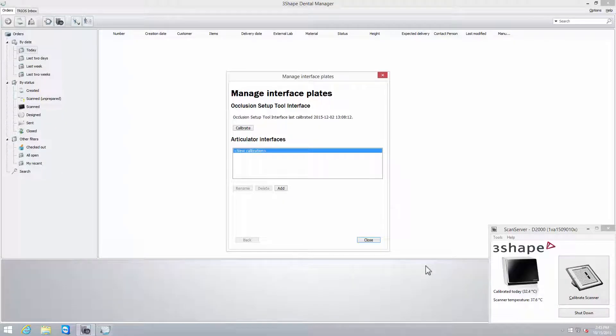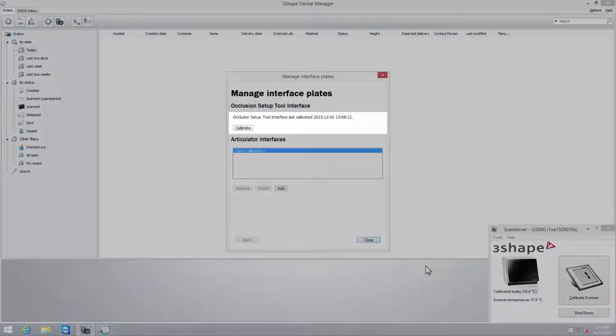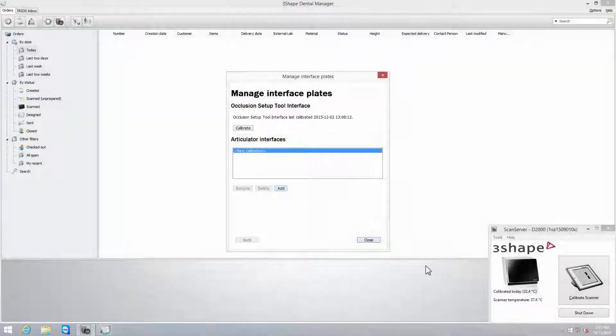In the Manage Interface Plates window, a new calibration date will be visible. Calibration must be done once, but we recommend recalibration if the scanner has been moved. Now you can close the dialog windows.